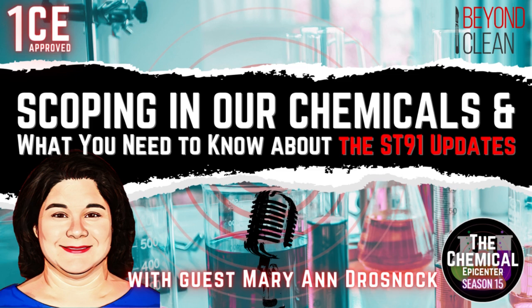So before we get to the 91 updates, though, we talked about detergent at the point of use. We talked about detergent in the manual cleaning process, but I want to spend at least a couple of minutes here talking about the next stage, like what happens after that manual cleaning stage to these scopes. And then we can jump into 91. Sure. So after the manual cleaning with detergent, it either goes on to high-level disinfection, which uses a chemical, high-level disinfectant, or it goes on to sterilization, which uses a sterilant, which is a chemical. So either way, it's subjected to further chemicals in order to have that terminal step of the process completed.